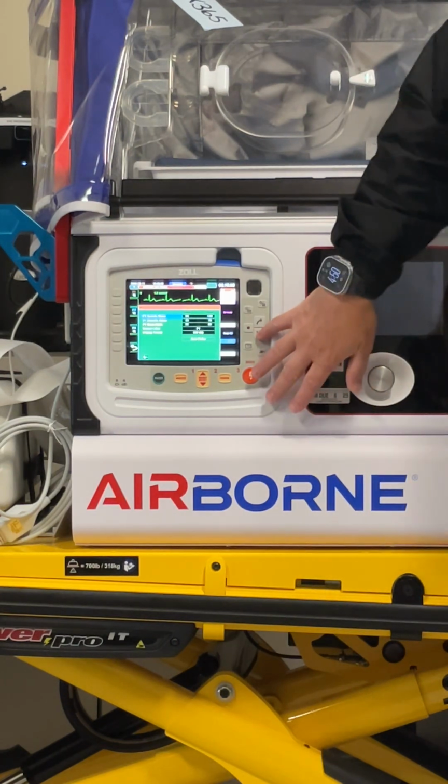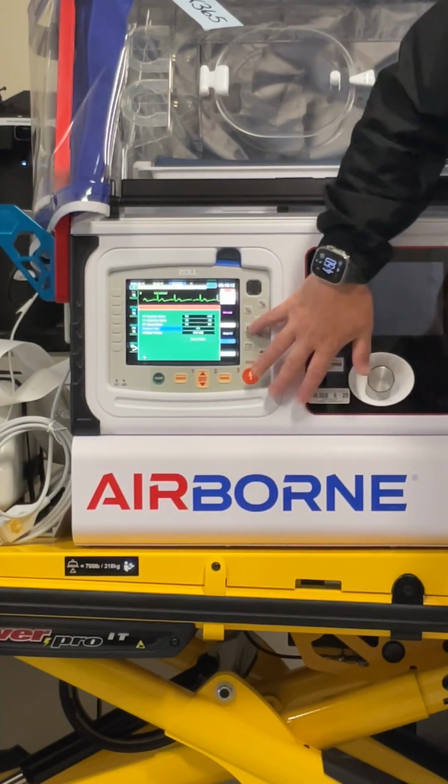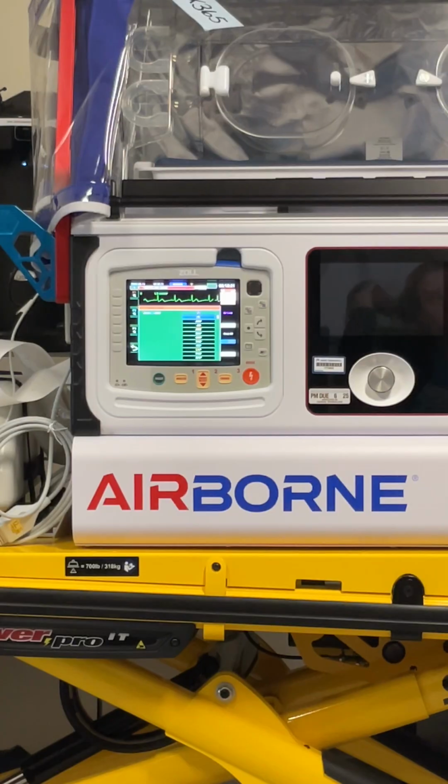So, you click on P1, you can scroll down to your source label, and away you go. We don't have a line to zero with, so we can't show you how to zero it because there's nothing to zero. But remember, if you have to close and cap, make sure you do it correctly.